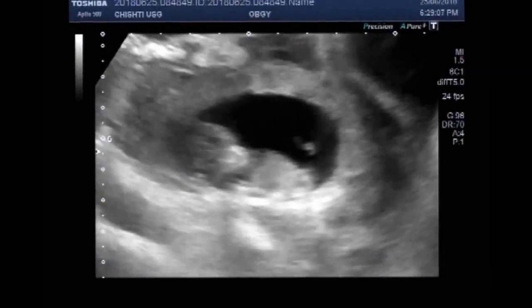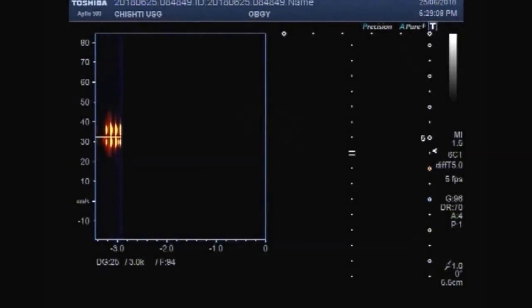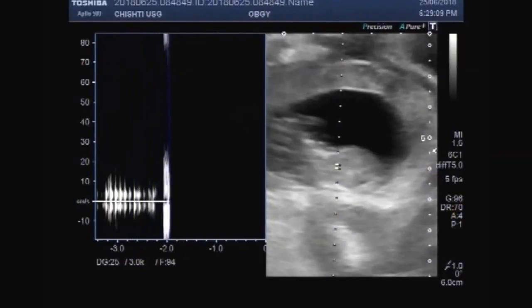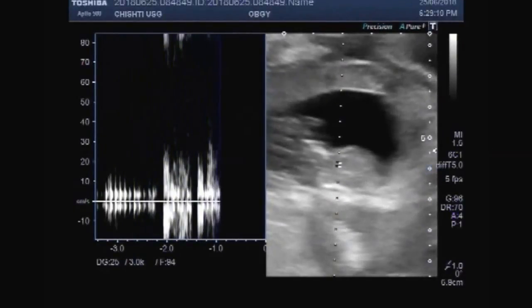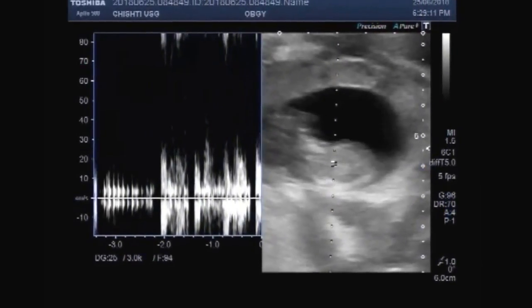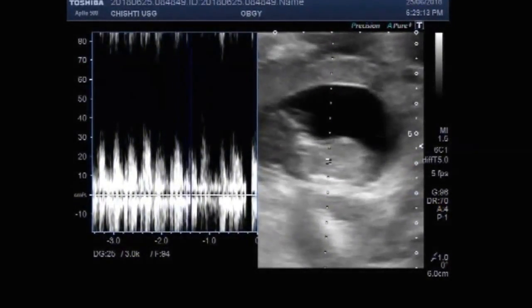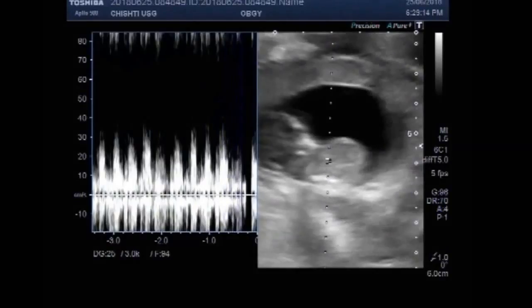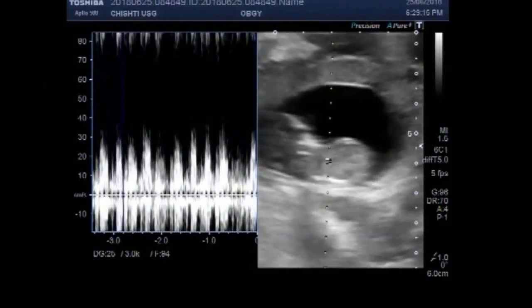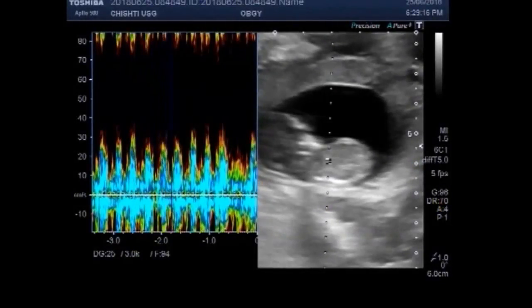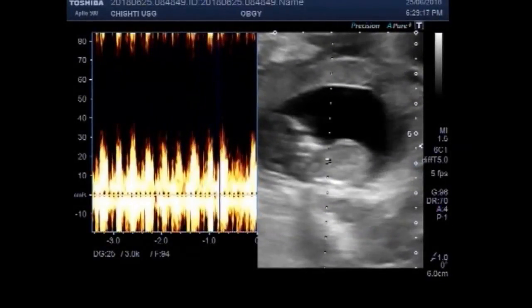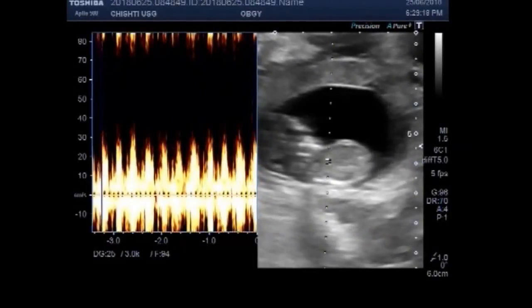Fetal cardiac activity is visible and audible.